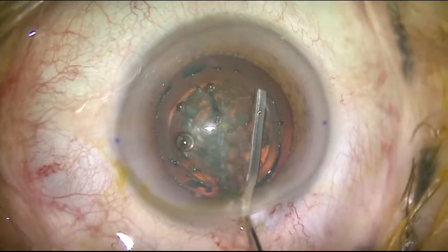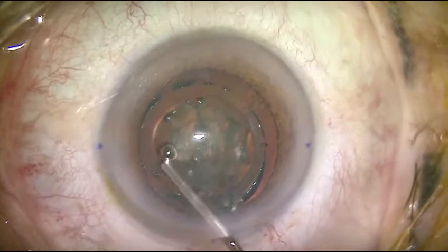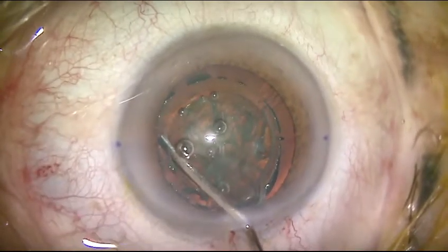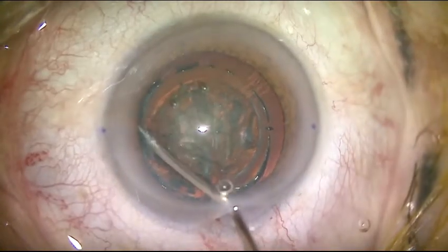Hydrodissection — gently. There are air bubbles present. Not over-pressurizing.